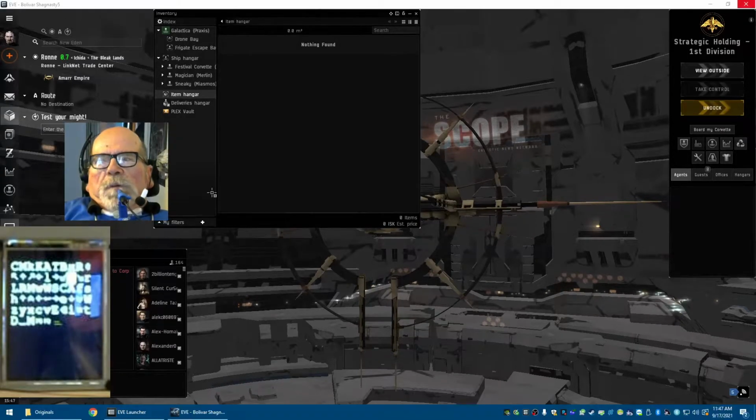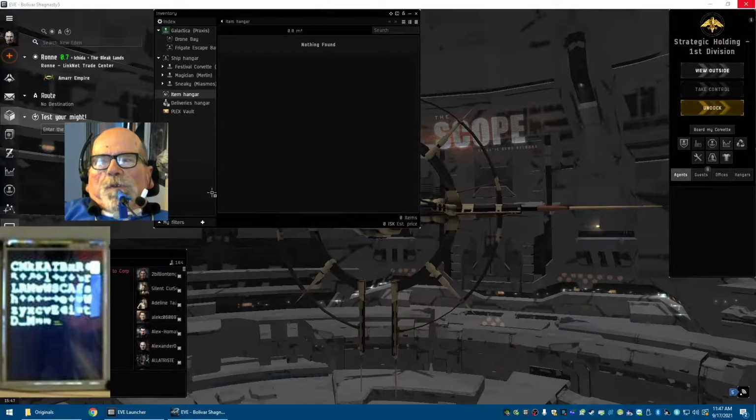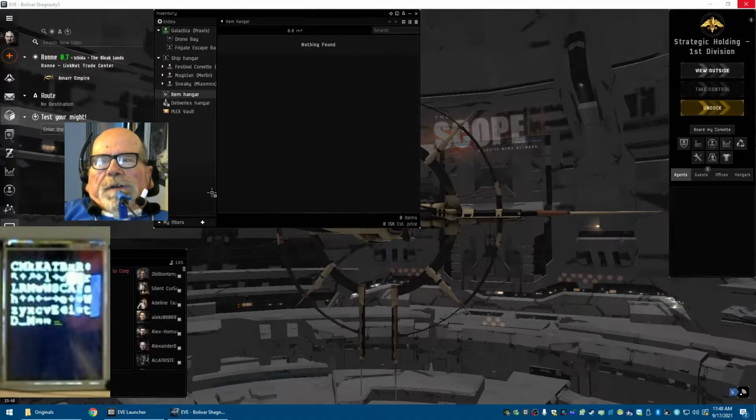So you can see me moving the cursor left and right on the screen. I can go down, I can go up, and if I go off the edge of the screen, I can make it go up and down also a little more easily. I have to push different combinations of buttons on my sling ring in order to move this cursor around.